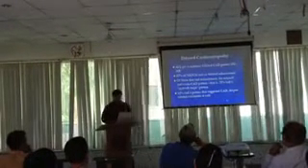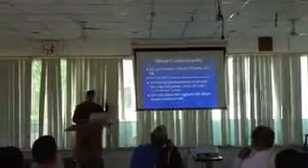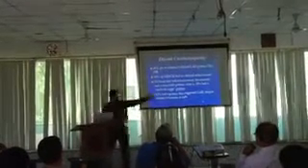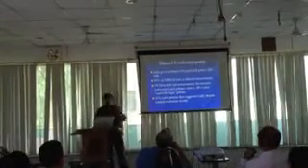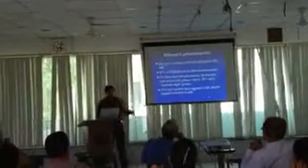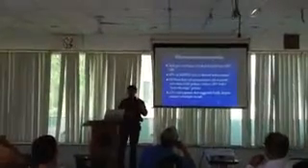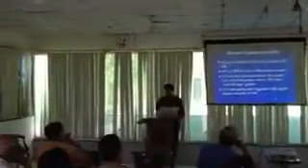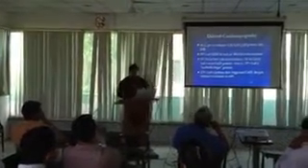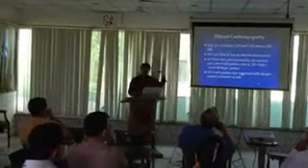60% of non-ischemic cardiomyopathy do not have delayed enhancement, so there won't be any delayed enhancement at all. 40% will still have delayed enhancement, of which 28% will have a mid-wall stria. This is important. Delayed enhancement in ischemia is subendocardial because that is the portion most affected. Delayed enhancement in non-ischemic is in the middle portion of the myocardium. So the subendocardium is not enhanced, the epicardial portion is not enhanced. Only the middle white strip will be seen.